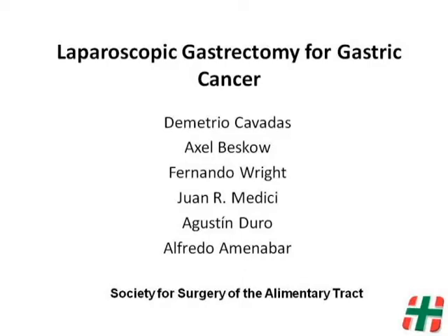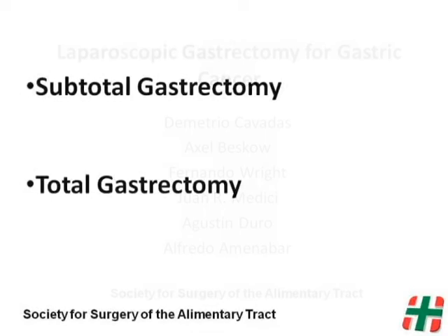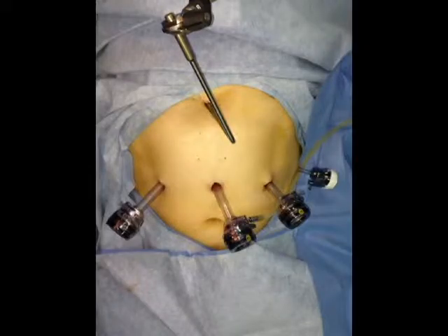Laparoscopic gastrectomy for gastric cancer. We present a video showing our technique for a subtotal and total gastrectomy with D2 lymphadenectomy. The patient was placed in a modified lithotomy position. Three 12.5 mm trocars were used along with a Nathanson liver retractor.